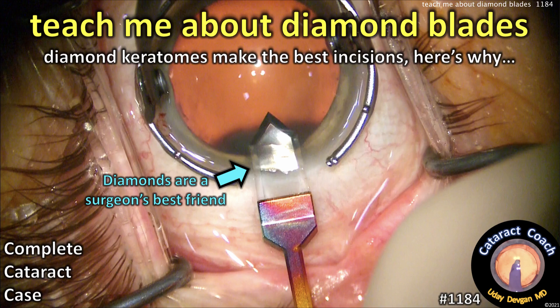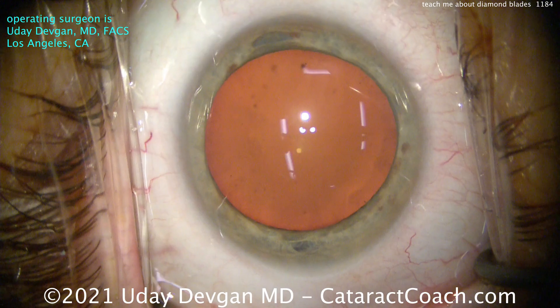CataractCoach.com. Teach me about diamond blades. Diamond keratomes make the best incisions, and here's why.